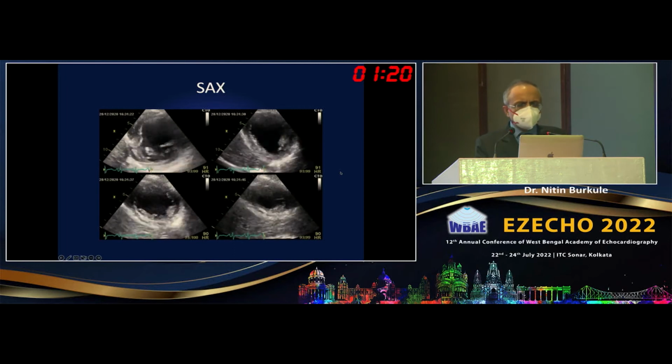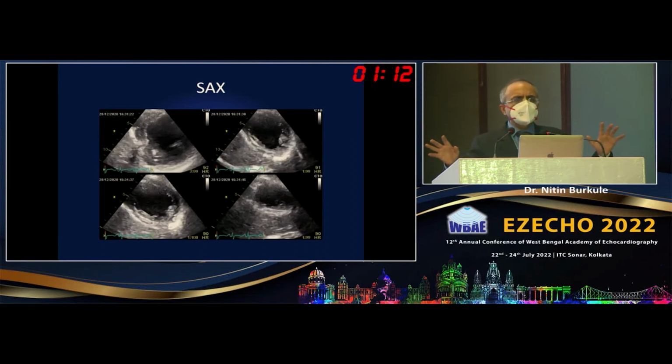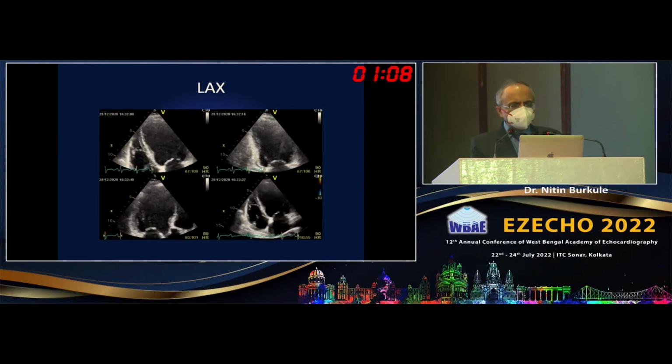Okay. Now here you can also see in short axis views that there is the inferior wall which is akinetic, there is some apical inferior which is akinetic. So that means this is a focal disease of non-coronary origin. Okay. And then we have these long axis images again showing the same thing. So let us look at now beyond this, we cannot characterize the myocardium. Okay. But we know that there is an irritability, there are VPBs, there is a basal septal, non-coronary territory akinesia. So we have to think of some granuloma somewhere.